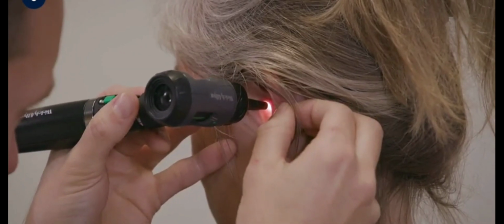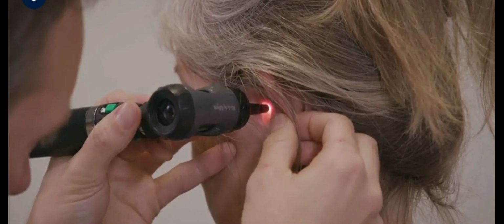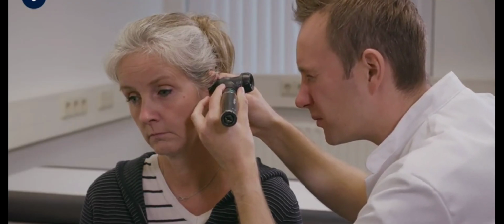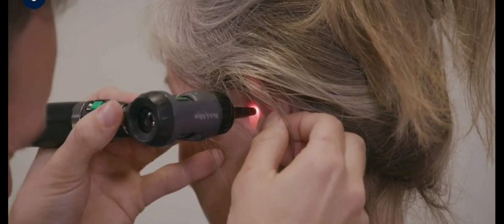In adults, the examiner can gently retract the pinna posteriorly and superiorly in order to straighten the external auditory canal. The external auditory canal is inspected for the presence of wax, scaling, inflammation or edema, evidence of discharge, or whether a foreign body is present.